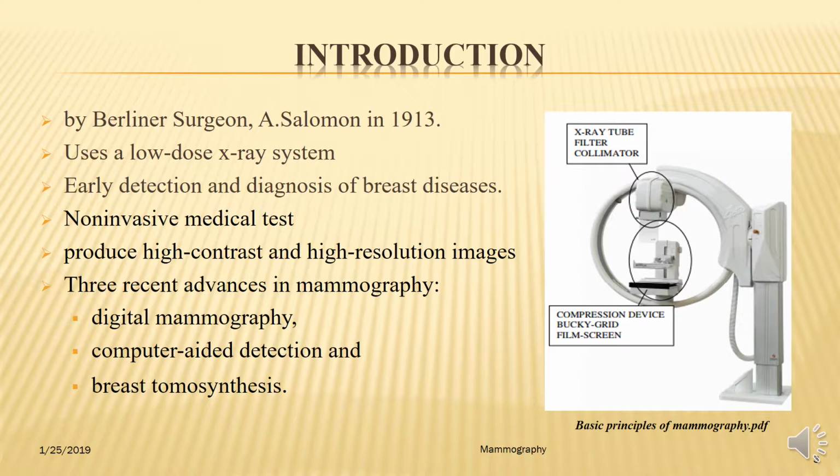X-ray radiography is a non-invasive medical test that helps a physician diagnose and treat medical conditions. Imaging with X-ray involves exposing a part of the body to a small dose of ionizing radiation to produce pictures of the inside of the body. X-rays are the oldest and most frequently used form of medical imaging.